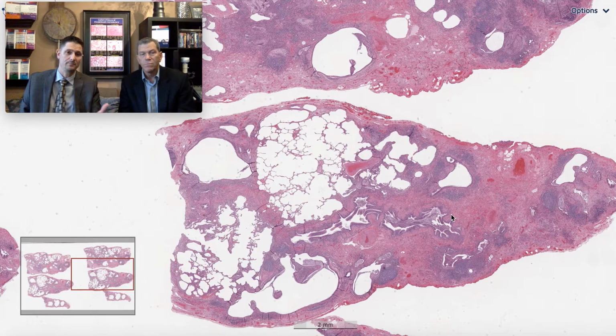Oh, absolutely. I mean, if this is my lung biopsy or my wife's lung biopsy, I'd want to see some immune suppression, some immune modulation, because we can see all those plasma cells. We can see all the lymphocytes. They're the ones that are mediating this injury. And an antifibrotic isn't going to do anything for that. Right. So this is a case of a general UIP pattern fibrosis in a patient with rheumatoid arthritis. This is not usual interstitial pneumonia of idiopathic pulmonary fibrosis.